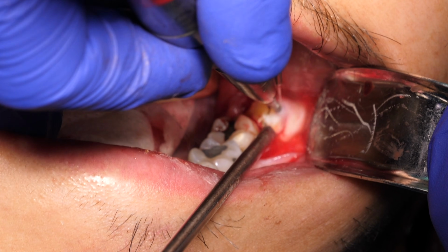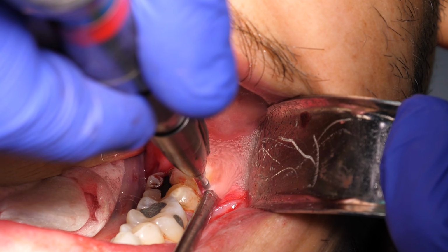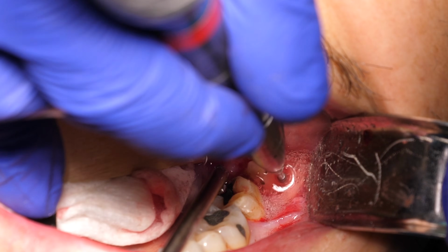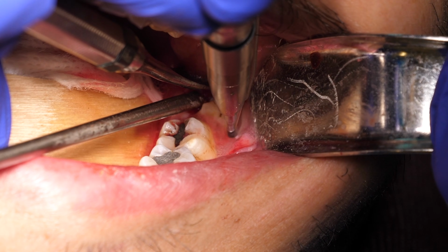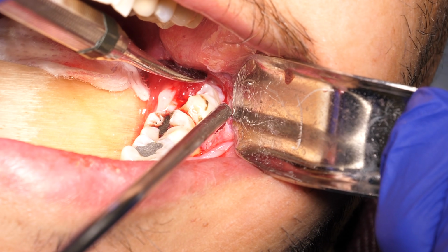As a dental student, the concept of a buccal trough is sometimes hard to grasp. I tell my students to imagine they're cutting a crown, and the technique is similar to doing a chamfer technique. The difference is you're cutting the buccal aspect of the mandible without touching the crown. The width of the buccal trough should be wide enough for a small straight or curved elevator head to fit in, and the depth should ideally be below the CEJ.